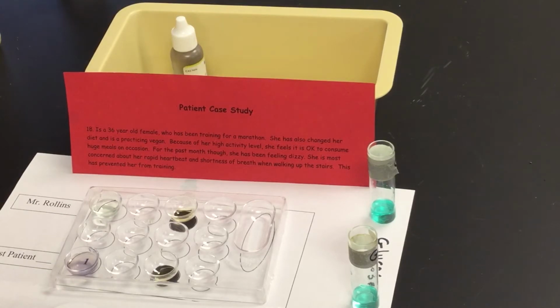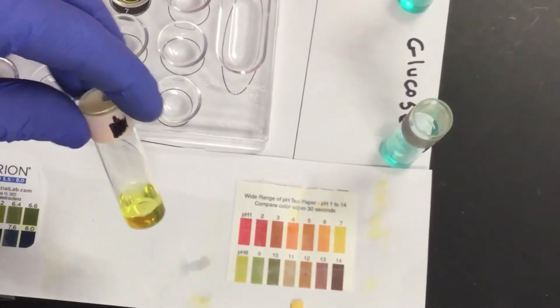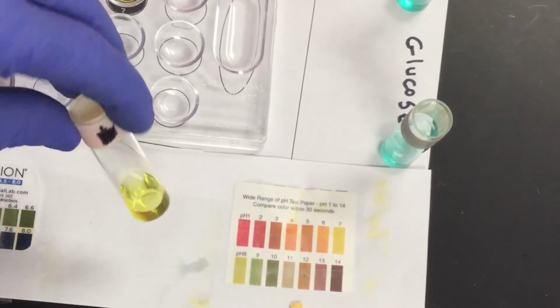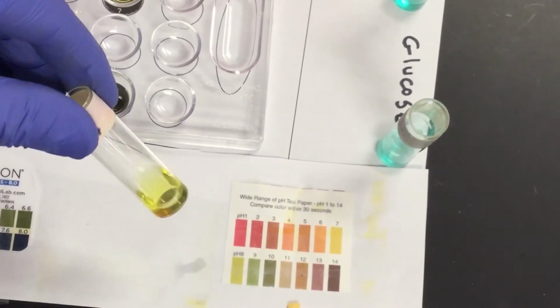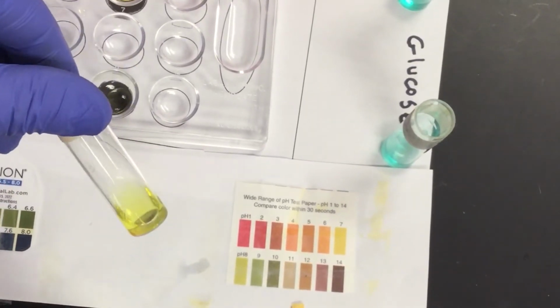So I'm going to go through this and compare Rollins, which you saw in the last video, to some of the things that you saw for this particular test patient number 18, who you have been assigned to. So the first bit that I have is I've taken number 18's urine. I've added it to a little glass tube so that you can mark color as well as clarity. Okay, so if you need to go back and look at Rollins's color, go back and look at Rollins's color. So there's my color.